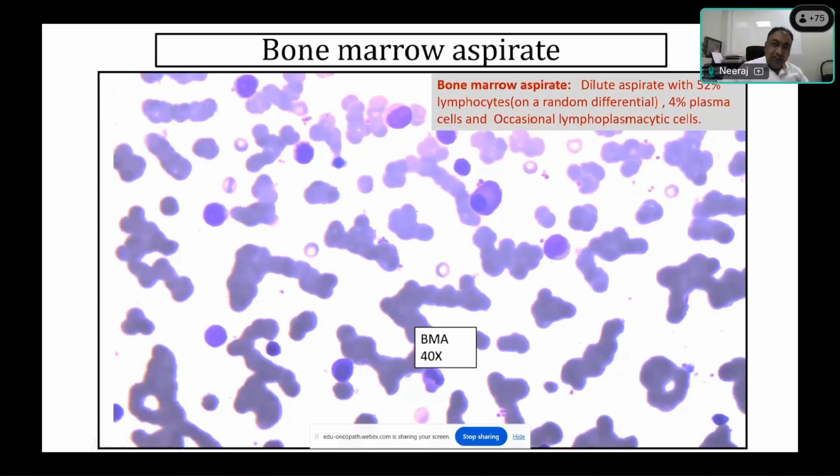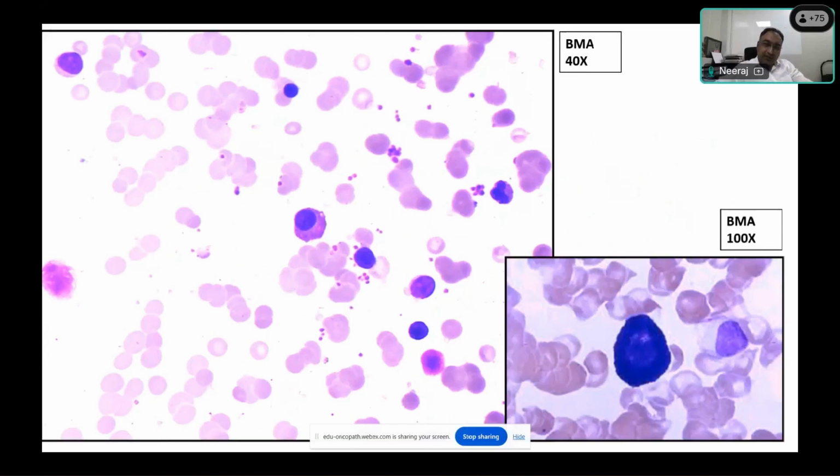And traditionally, this is a further slide showing the lymphoplasmacytoid cells, plasma cells, and you could see some other cells. You notice some other cells. These are mast cells in the bone marrow aspirate, and I have highlighted these for a particular reason in this scenario. So, noting such abnormal cells in a scenario of LPL is very significant, and typically they help you identify the Waldenström.